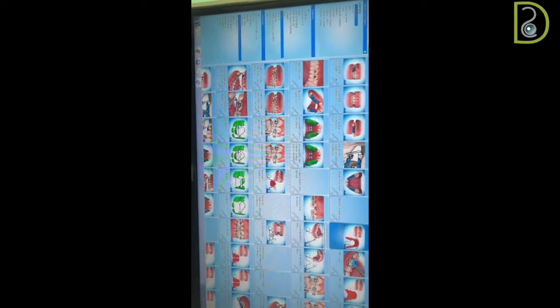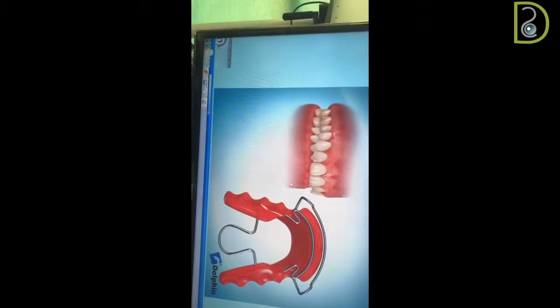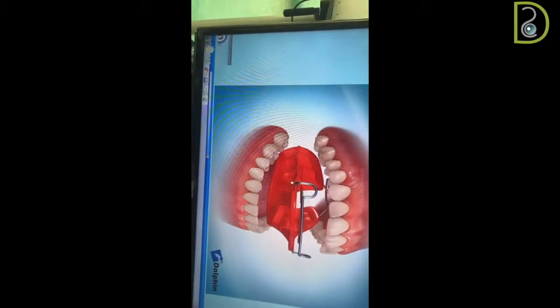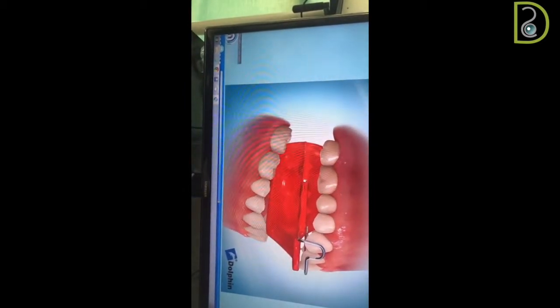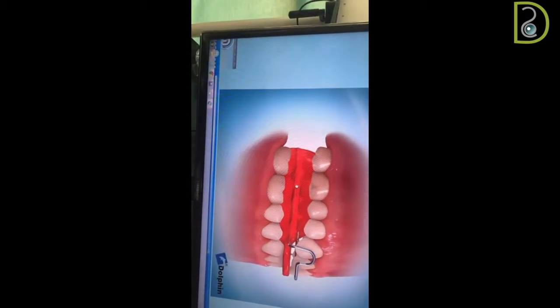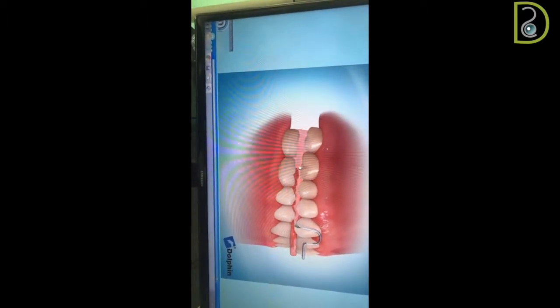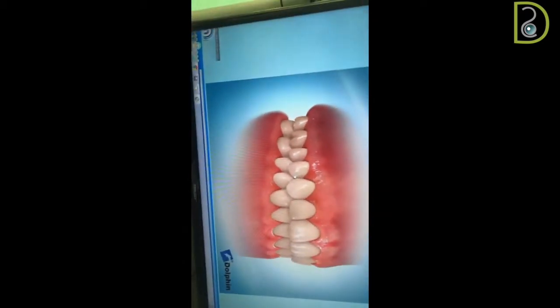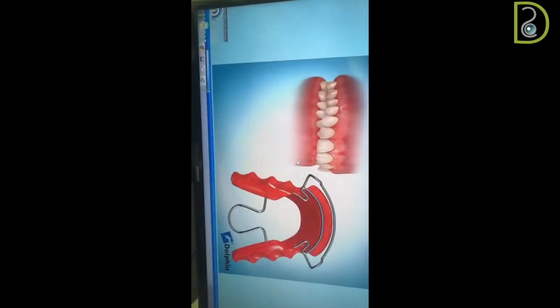Like, you know, the bionator appliance. Such appliances require lab support. You need a good technician. The problem with them is they are bulky, and I used to use these appliances, the removable appliances. I know that there are many orthodontists in the world that use these removable appliances. I don't use them because I had difficulty with my patients.